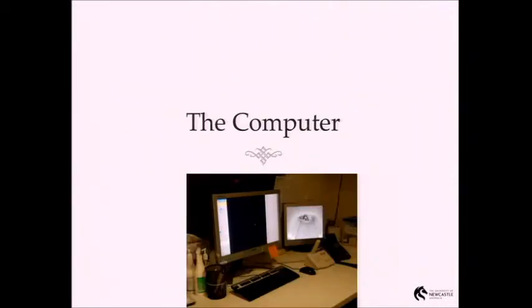Nearly done. As I said, this is where the radiographer sits. So this is the computer system. A couple of things to note here. This is where that interface comes up, a keyboard to make changes, and a system whereby you can talk to the patient with a microphone while it's making all that thumping noise in there. Obviously you don't want to be sitting out there all day listening to that. You only want to be able to communicate with the patient when it's quiet in there between scans, find out they're A-OK, got any problems. And characteristically there's a camera at one end of the bore, so you can keep an eye on what's going on in there. You can see if they're moving, if they've had a contrast reaction or are in distress or whatever.